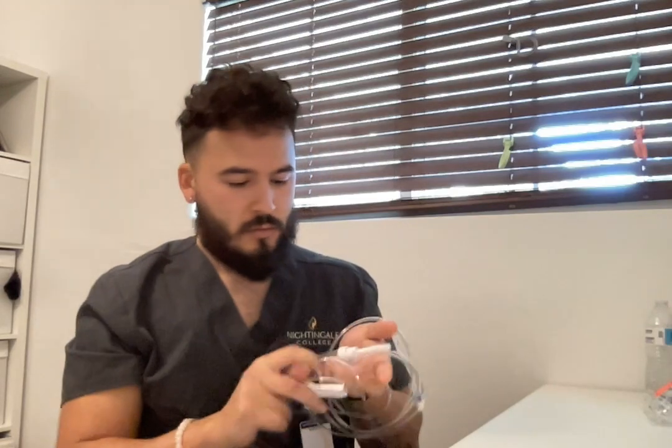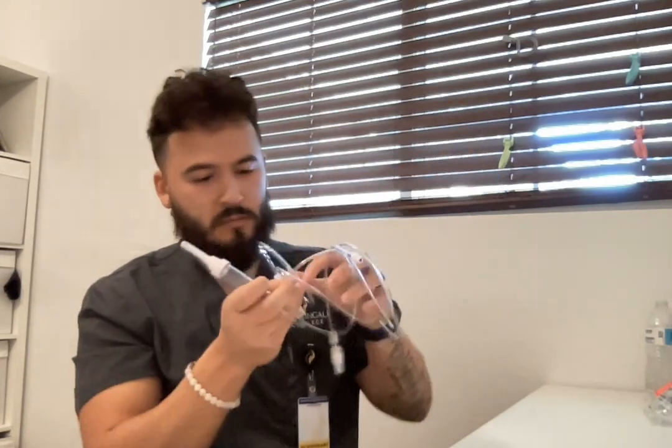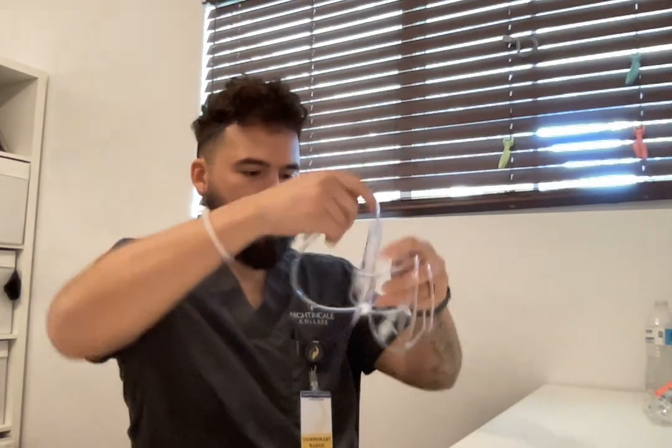So a little bit about the equipment. It's a little tied up. So we have our sterile needle. We're going to keep this sterile until we puncture the bag. This must always remain sterile. Then we have our drip chamber. This drip chamber is where the fluid is going to essentially hang.